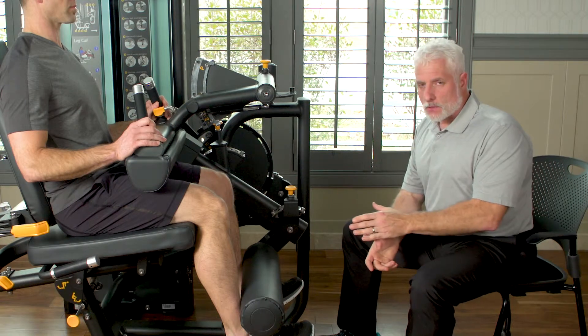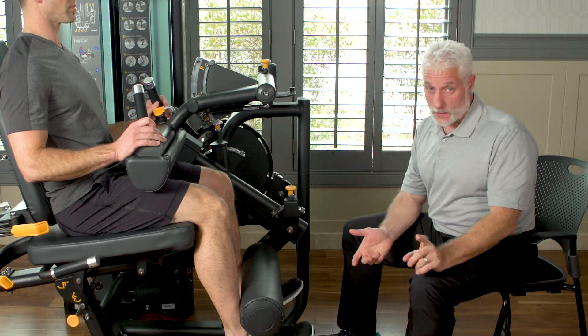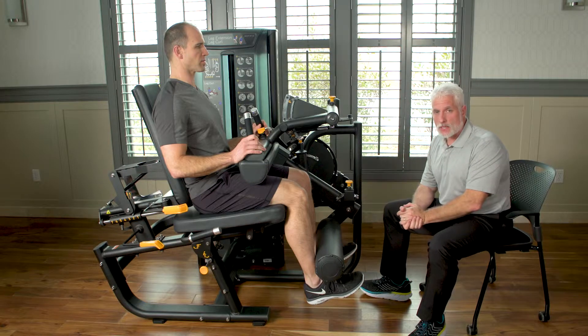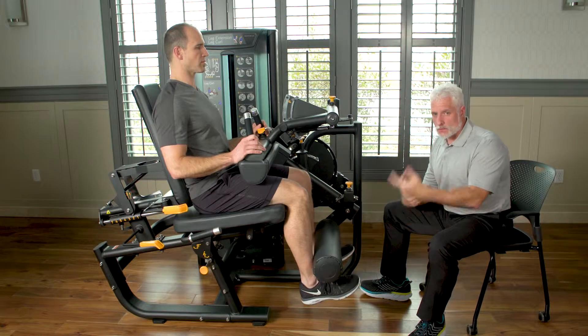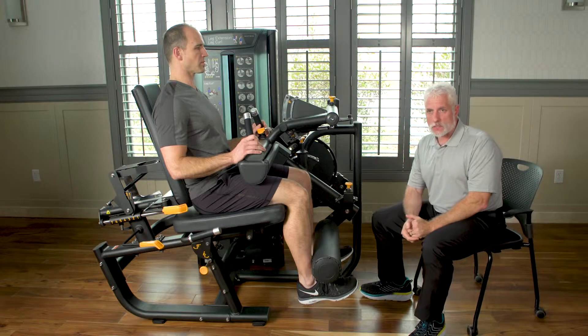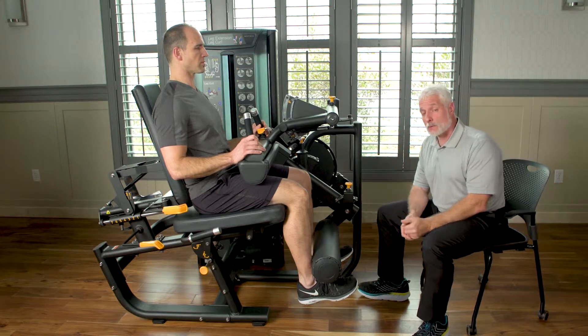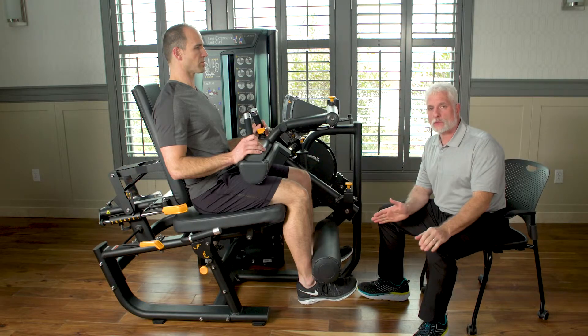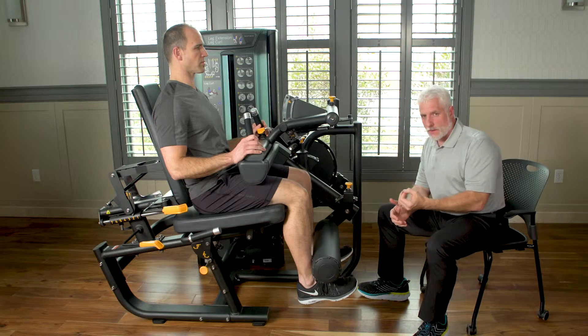The next patient population to really focus on is total joints. You see them four, five, or six days out of surgery, and once you do, you want to gain strength back as soon as you can. I put patients on this machine six days out of surgery just to start getting some quad firing — range limited, lightweight, just getting the quad to fire.